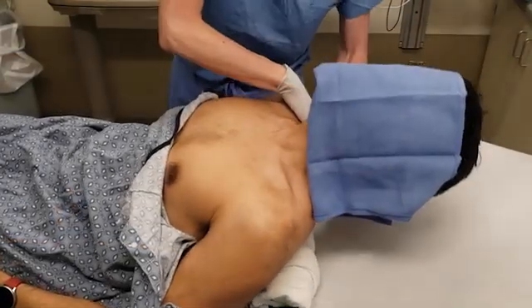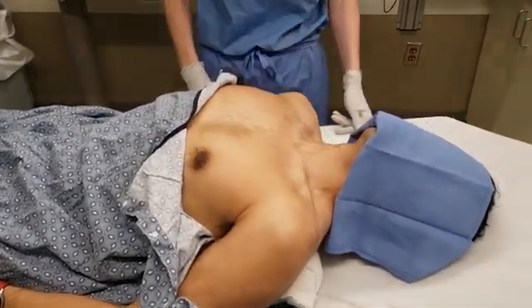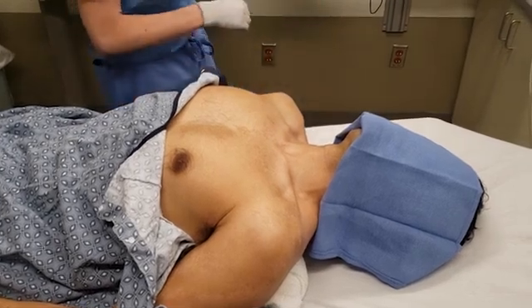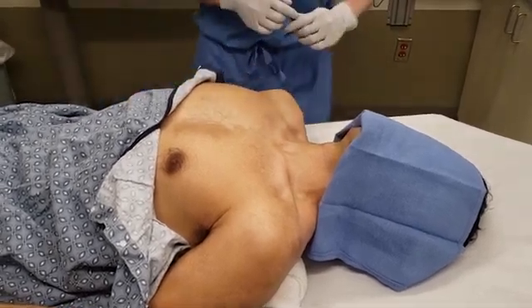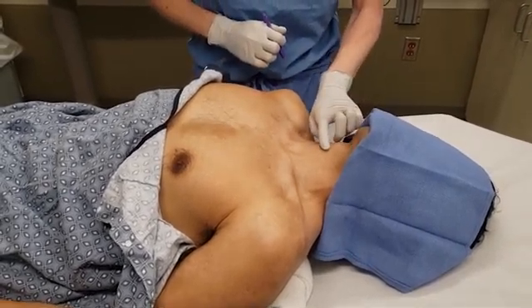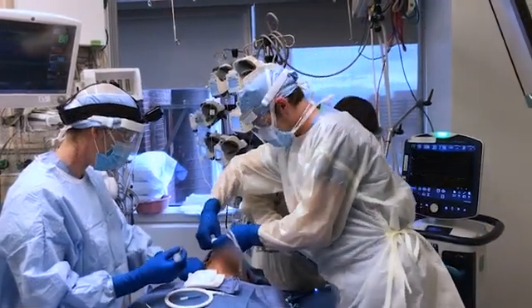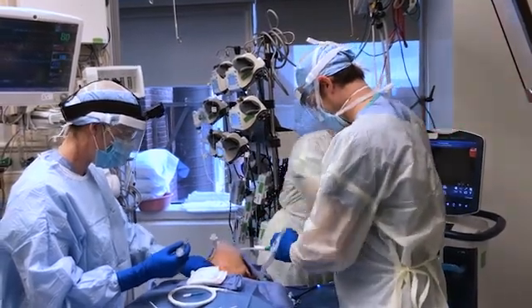Place the patient in the supine position. Placement of a shoulder roll beneath the patient's scapula can help to extend the neck and improve exposure of the anterior neck. Make sure that the patient's head is supported by a towel or small pillow if necessary. The surgeon should be able to comfortably access the patient's neck while standing, so adjust the height of the bed as needed.